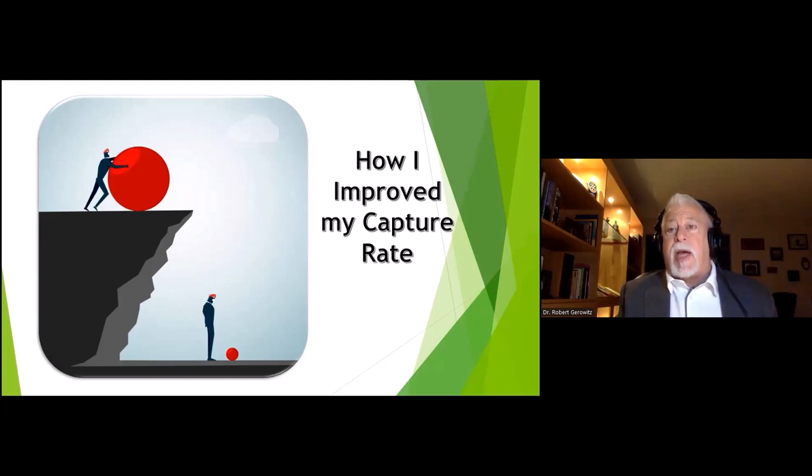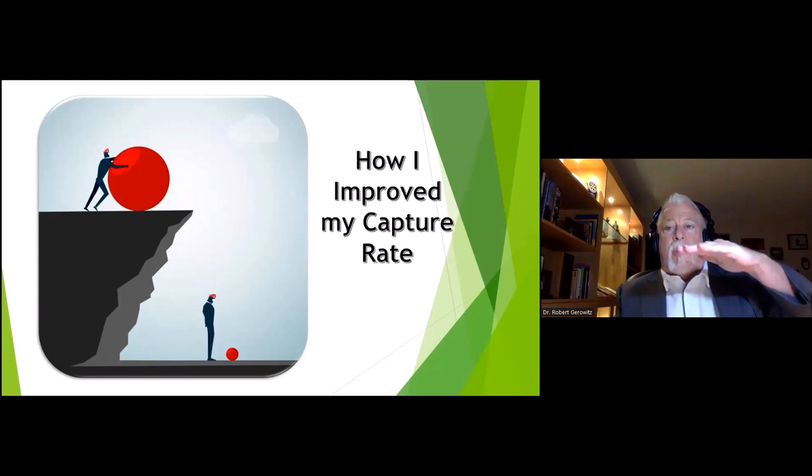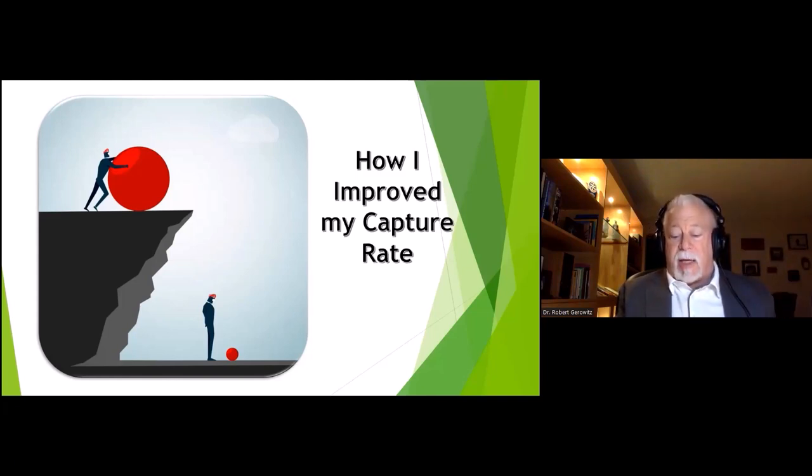And so I'm going to take a page from Dr. Tom Wyszewski's playbook. When he tests VAs uncorrected, he starts by having them read the lowest line and work their way up line by line. So eventually they'll find something that they can read.